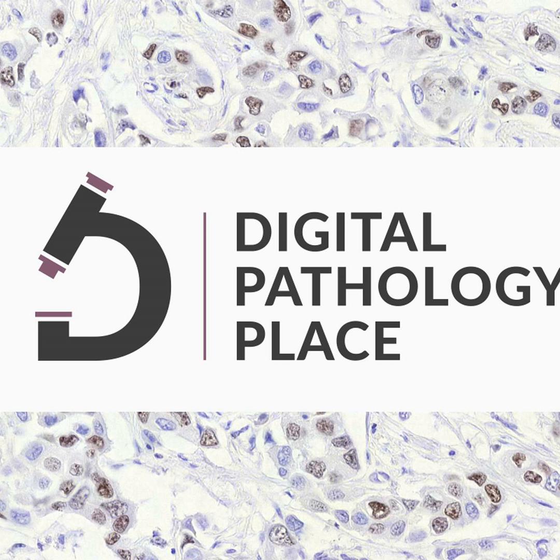So space on the table or lab bench, and also the room around it, because it's not only the space for the scanner, but most of the scanners, ours, I know for sure, come with a monitor, a keyboard, a mouse. So you need space for that as well, like a small work area, at least maybe 2 foot wide or 30 inches wide for those parts of the system.